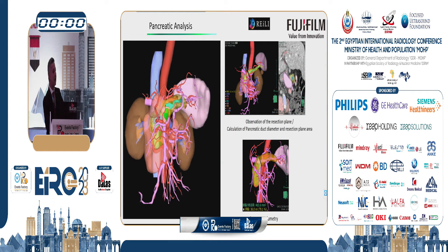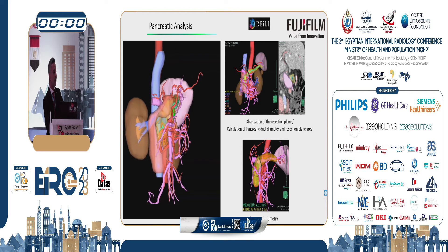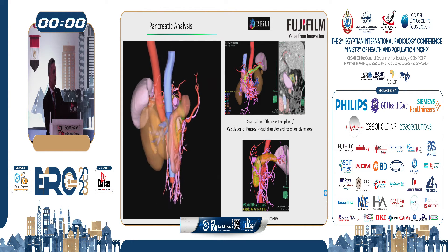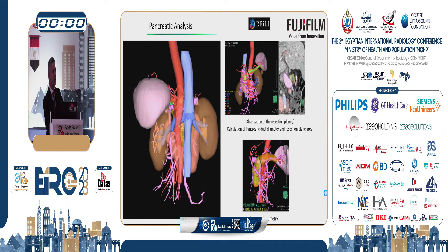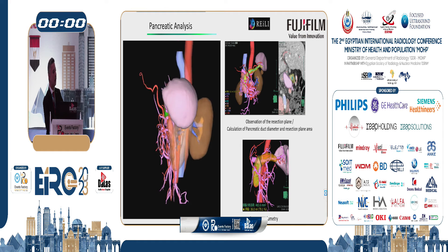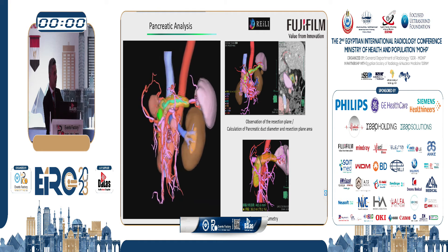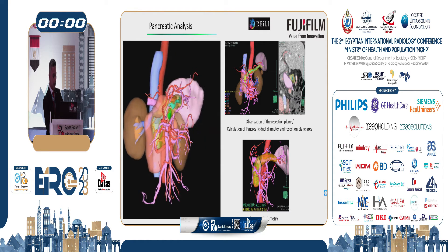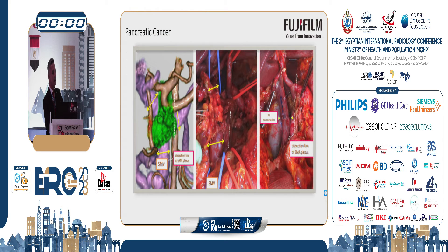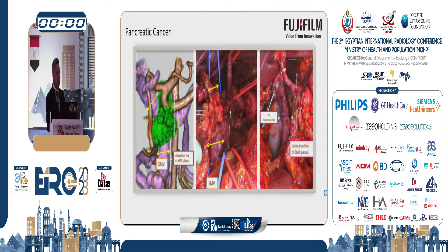Another module is the pancreatic analysis. Synapse 3D is able to detect, separate, segment, and extract all pancreatic lesions or the pancreatic body, as well as the splenic and venous structures — including the pancreatic vein and artery — and simulate surgical planning. Based on artificial intelligence, Synapse 3D can determine and measure the volume of pancreatic cancer, detect its stage and nature, and differentiate whether the cancer is malignant or benign.